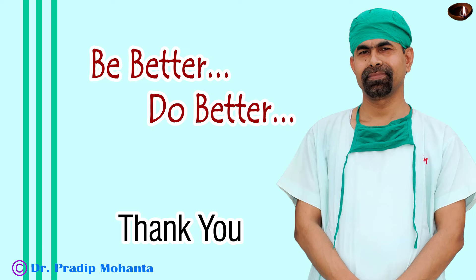The case is concluded. Thank you very much for your attention. I hope this video will help you in developing your surgical skills. Please learn the submarine chop technique to manage hard cataracts — you deliver all the ultrasonic energy within the substance of the nucleus and the cornea is crystal clear the next day.